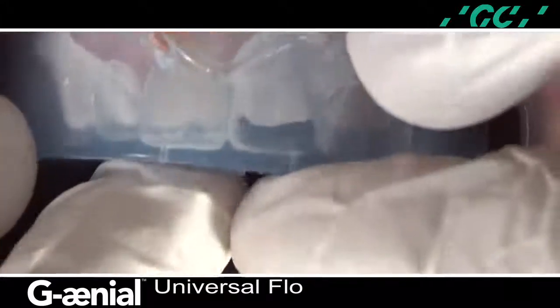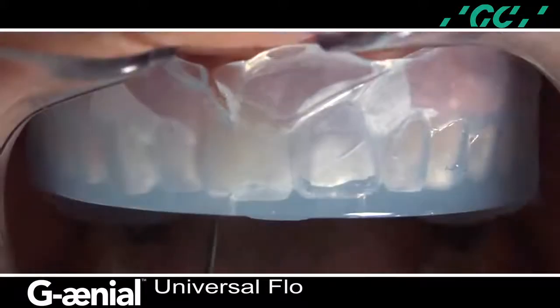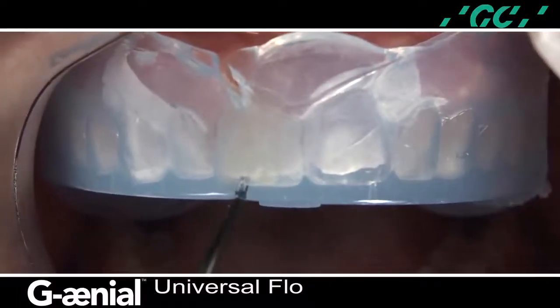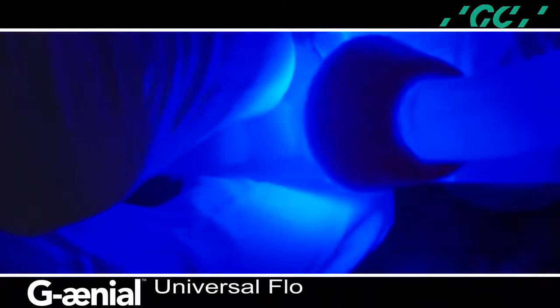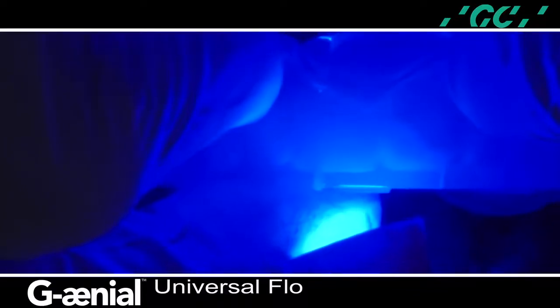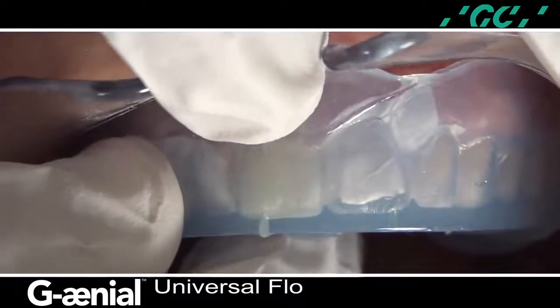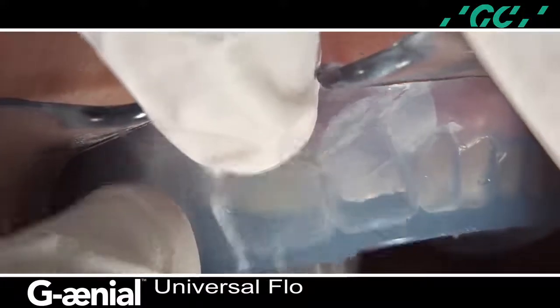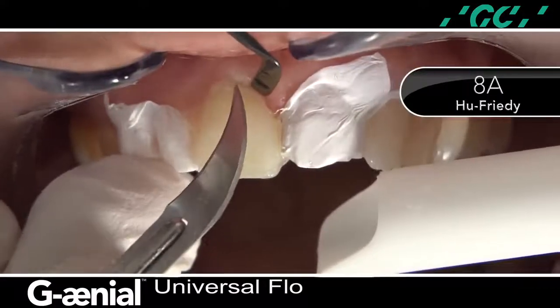The clear silicone matrix is precisely placed over the maxillary arch and inspected for a complete seat and seal. A B1-shaded flowable composite resin, Genial Universal Flow, was injected through a small opening above the right central incisor. The composite resin is light-cured through the clear resin matrix for 40 seconds from the facial and 40 seconds on the occlusal lingual. It is important to maintain a constant finger pressure on the buccal and lingual ends of the matrix to ensure a tight seal of the silicone to the gingival interface and optimal adaptation of the material to the tooth surface. The clear silicone matrix is removed and excess polymerized composite resin was removed with a scalpel blade, a number 12 BD Bard Parker, while the gingiva is reflected with an 8A instrument to prevent tissue laceration.